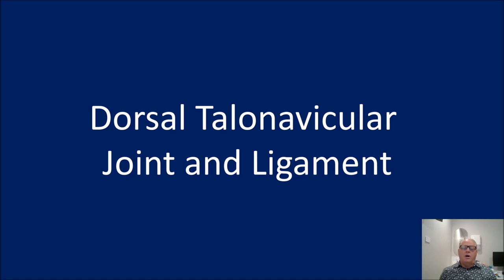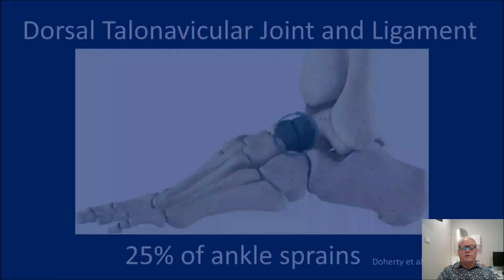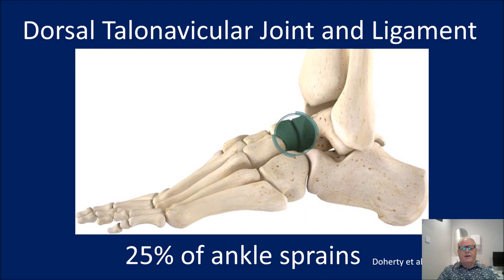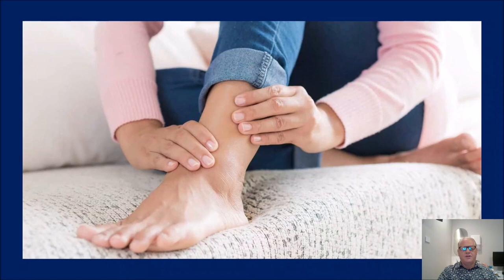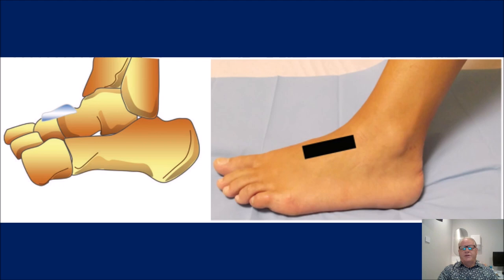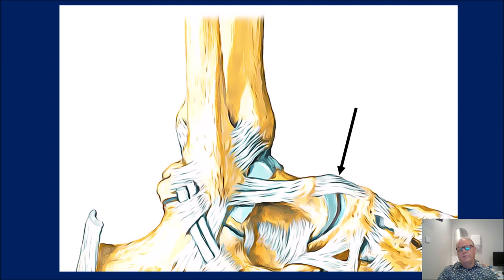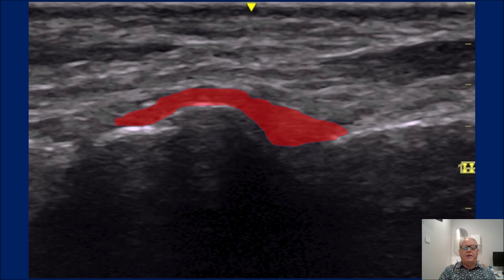Dorsal talonavicular joint and ligament — this is becoming increasingly fascinating. People will come along and point to the front of their ankle saying 'that's where I've got the pain.' About 25% of all ankle sprains I scan have an issue in this region. This is the probe position for the dorsal talonavicular ligament — and this is what it looks like, a normal dorsal talonavicular ligament.